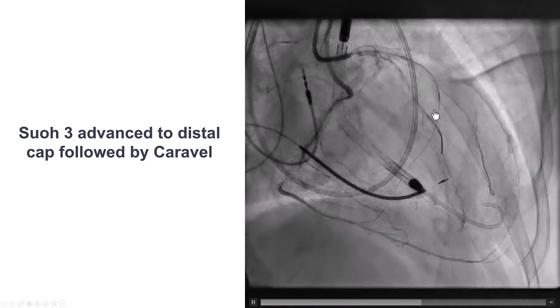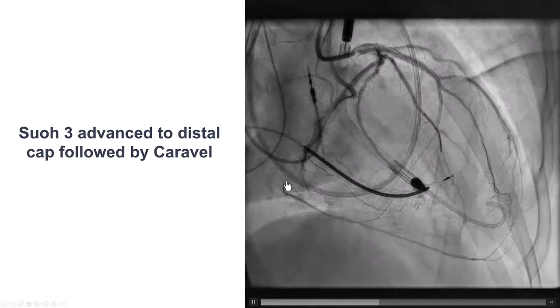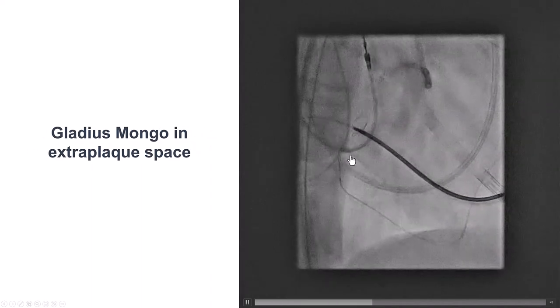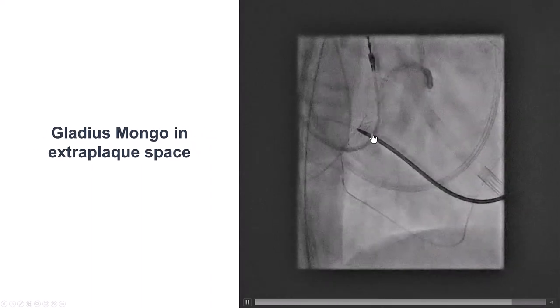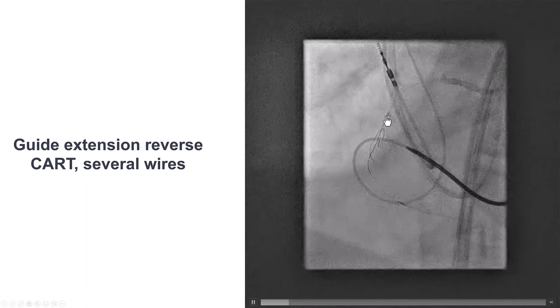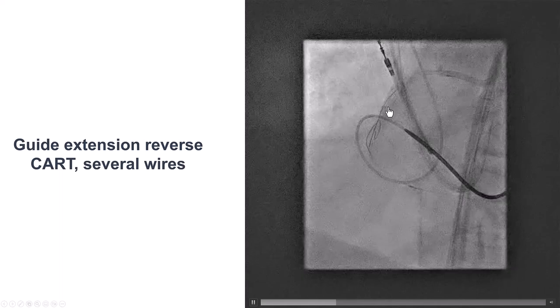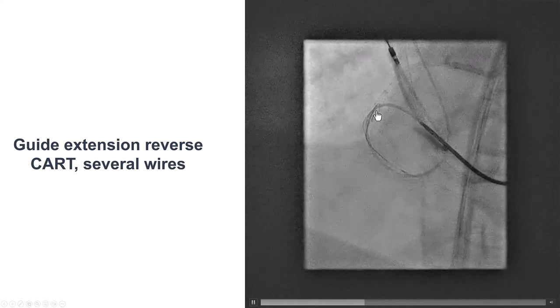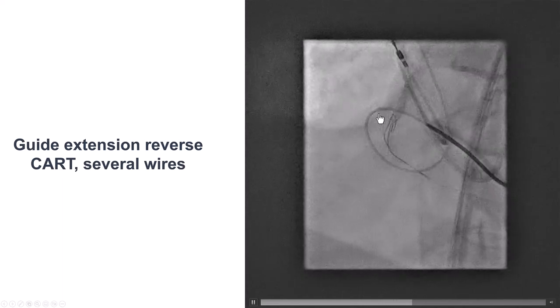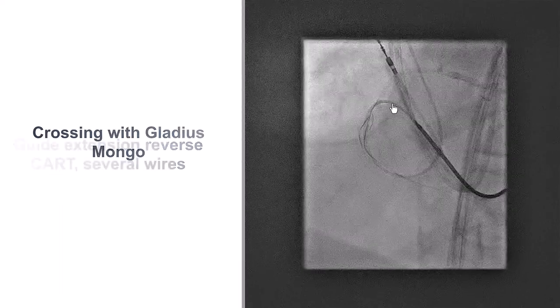We then advanced a Caraval microcatheter all the way to the distal cap. We can see that the length of the occlusion is relatively short. We then advanced a retrograde Gladius Mongo guide wire that appeared to be knuckling and going into the extraplaque space. So we have the antegrade equipment including the guide extension in the true lumen, whereas the retrograde is in the extraplaque space.